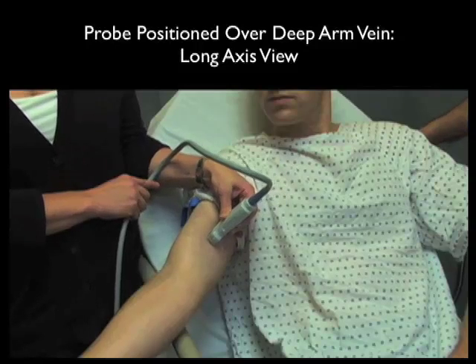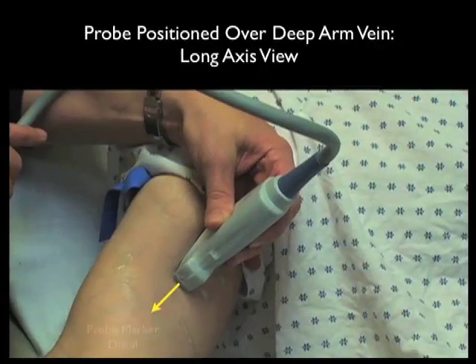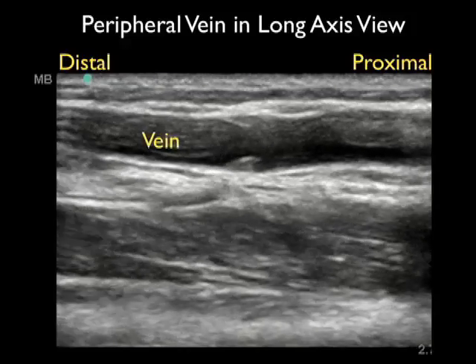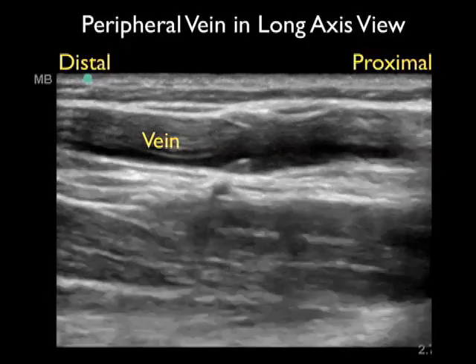Here's the high frequency linear array probe in a longitudinal or long axis orientation over the patient's upper arm, located over the more medial basilic vein. In this orientation, we have the probe marker going distally, and the screen indicator dot is located towards the left — therefore distal on the screen is towards the left and proximal is towards the right. Here's a typical appearance of a venous structure cut in long axis: the vein has a tubular appearance, with blood flowing from the left, which is distal, towards the right, which is proximal.